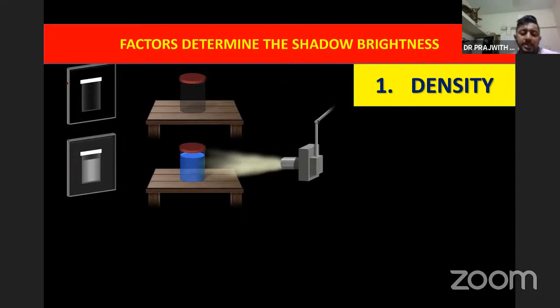Now see the second image. I have filled it with water. Now what happens? The water will stop more X-rays.